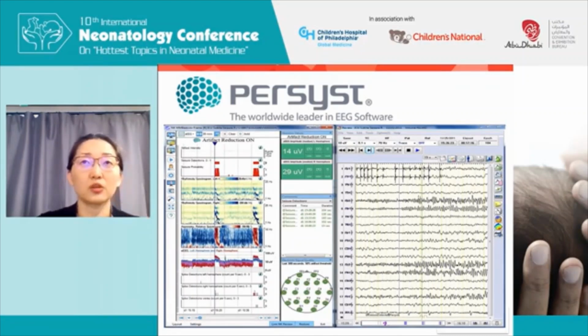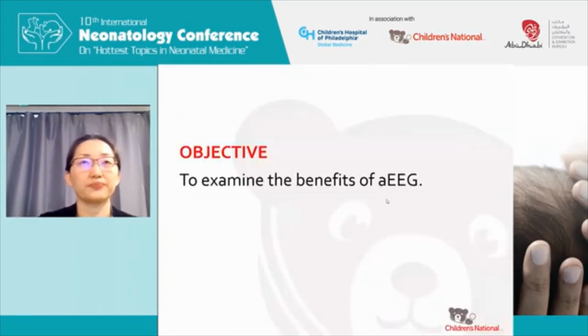So in our NICU, not only do we display the full EEG montage, but we actually display above it a right and left amplitude-integrated EEG tracing so that our neonatologists still have access to it and can review it, but we don't need to have 2 devices running at the bedside.